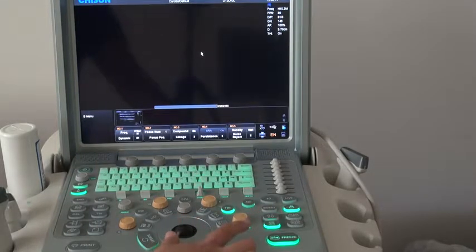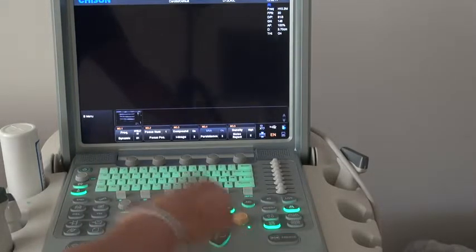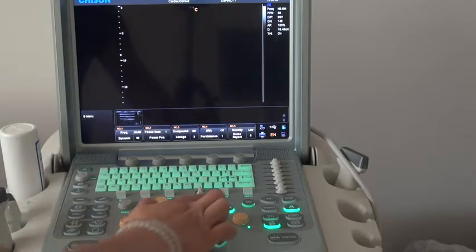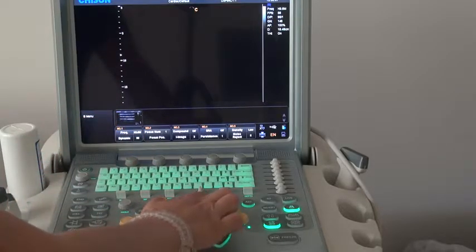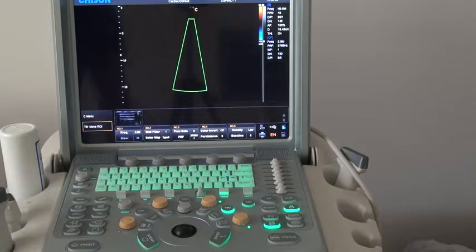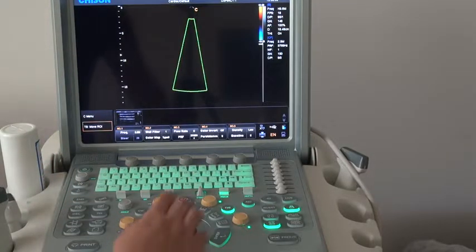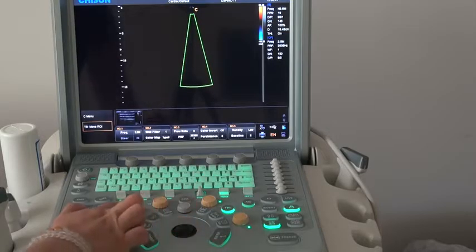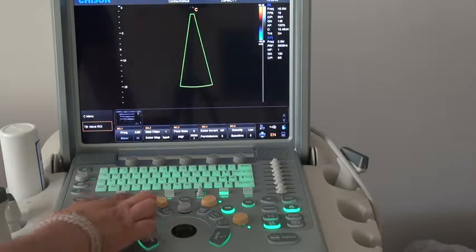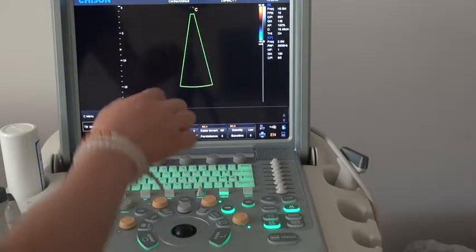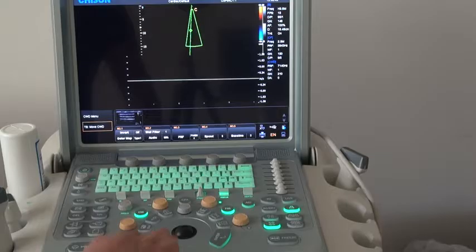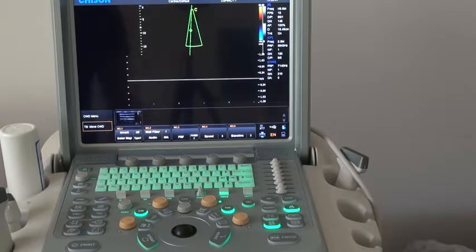In B mode, first we want to go to CW mode. Press the C key to go into color mode, and then press the CW key to go into CW mode. Press the update key to get the spectrum.